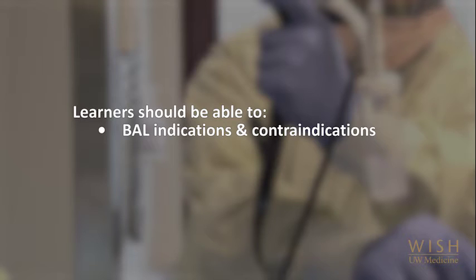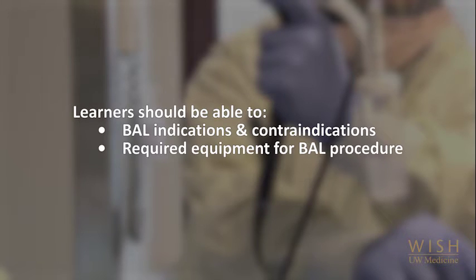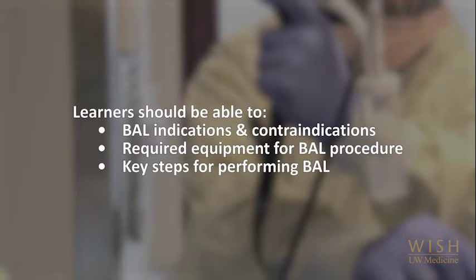in critically ill patients. He or she will be able to identify the required equipment necessary to perform this procedure, and the learner also will be introduced to the steps necessary to execute this procedure safely.